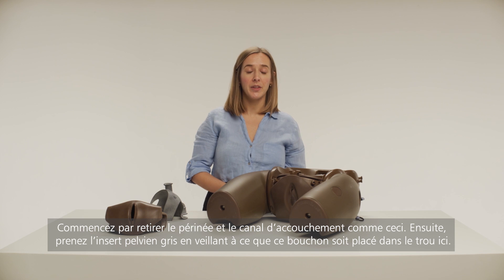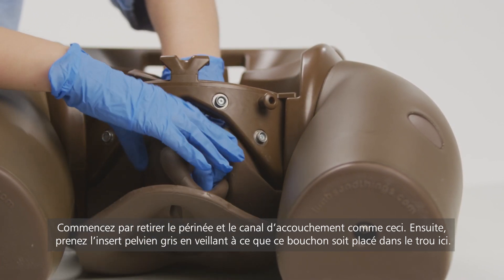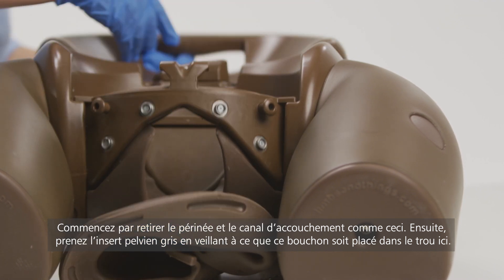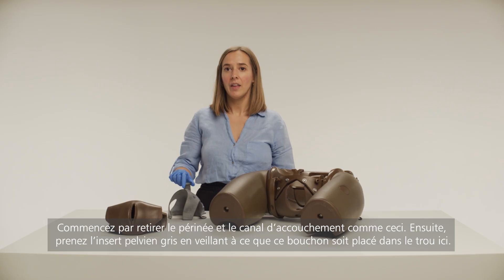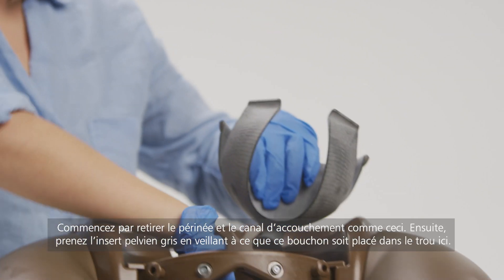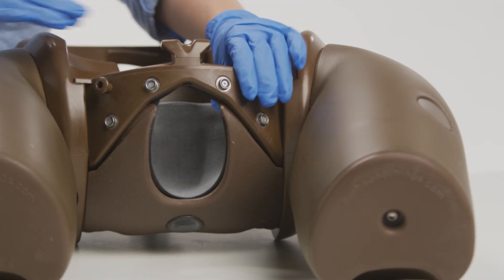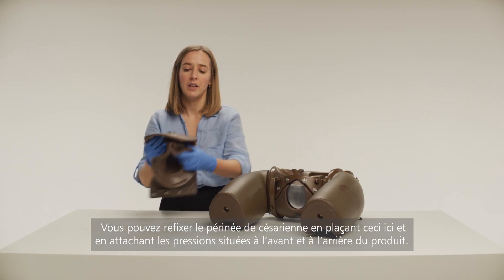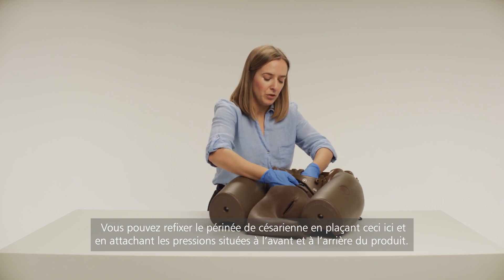Start by removing the Birthing Perineum and Birth Canal, like so. Then take the grey pelvic insert, ensuring that this bung goes through the hole here. You can then reattach the C-section Perineum and Birth Canal by placing this through here.